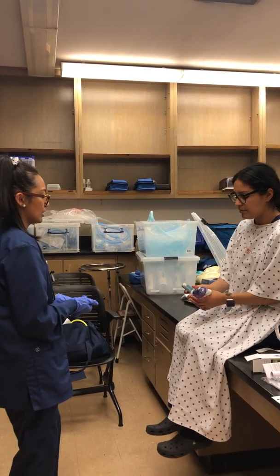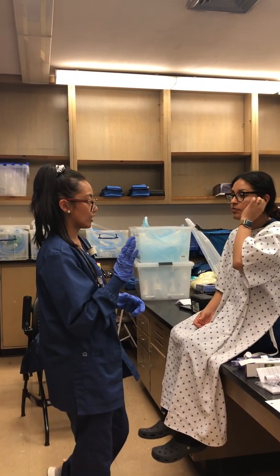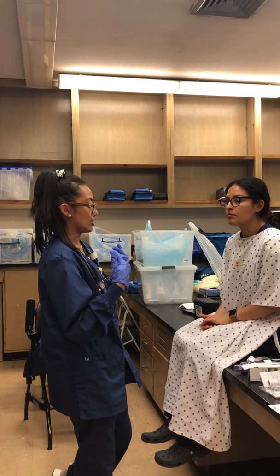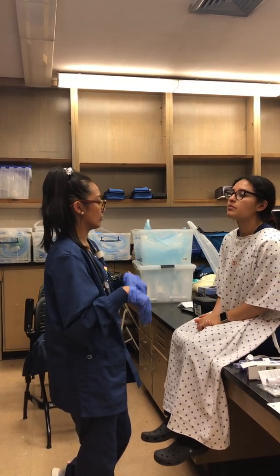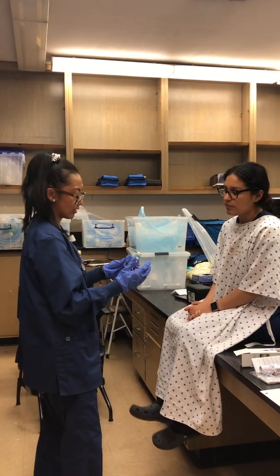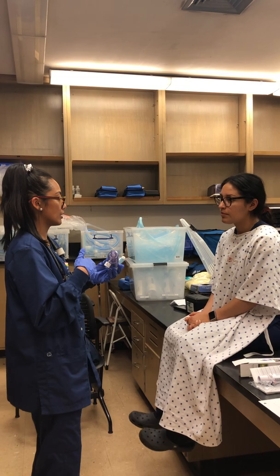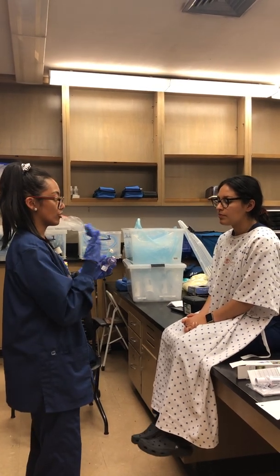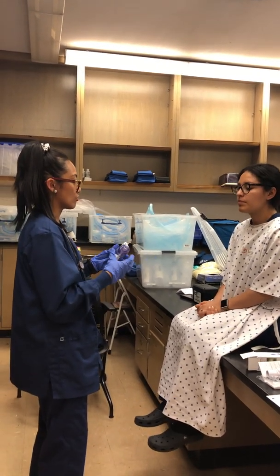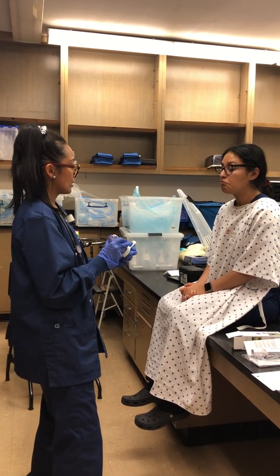Okay, awesome. And the reason why we have you exhale through the nose is so that if you exhale through the mouth, you're going to release all that extra medication that's in your lungs and it'll just come back out. So it sounds good. And the reason why we use this is for better deposition of the medication to actually get into your lungs and stay there rather than it hitting your teeth or the back of your throat causing dryness or irritation. Okay, you have any questions so far about this?